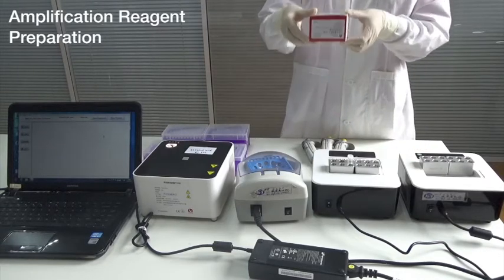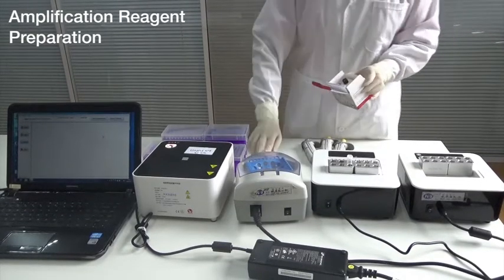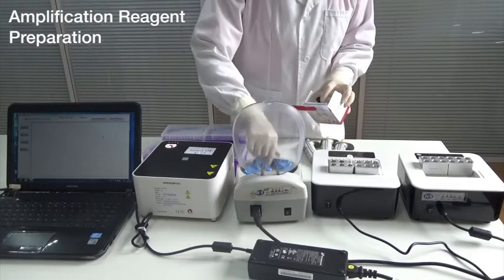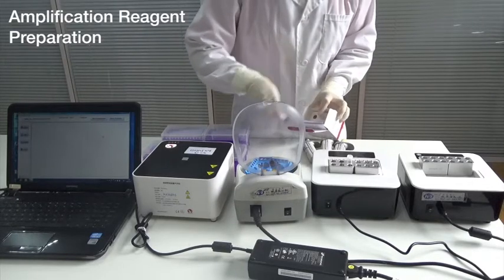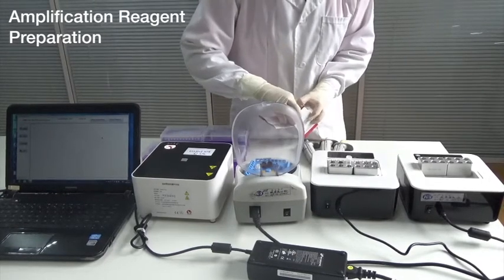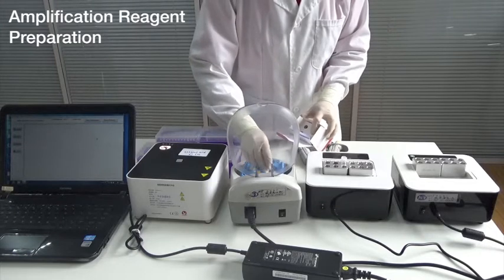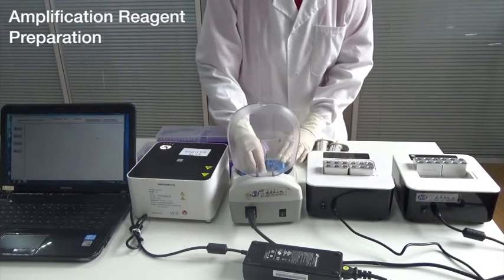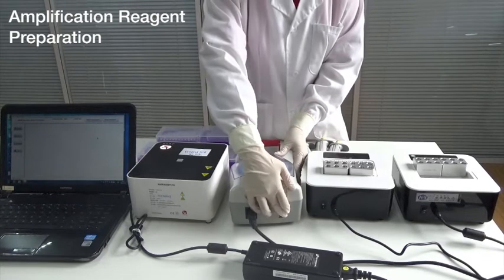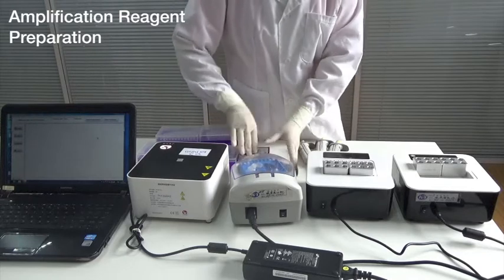First steps: amplification reagent preparation. First, take out the reagents, vortex and short-spin after dissolving.